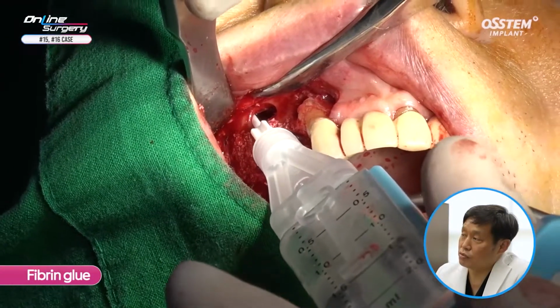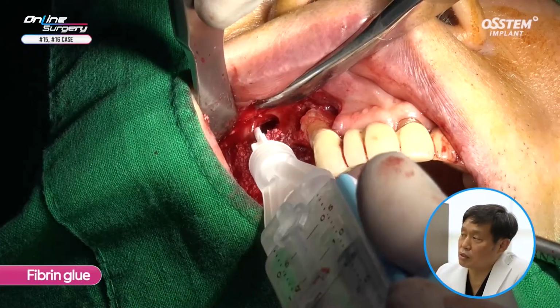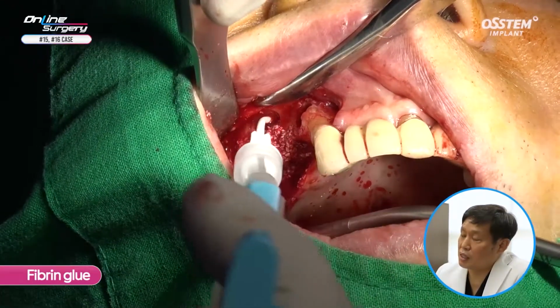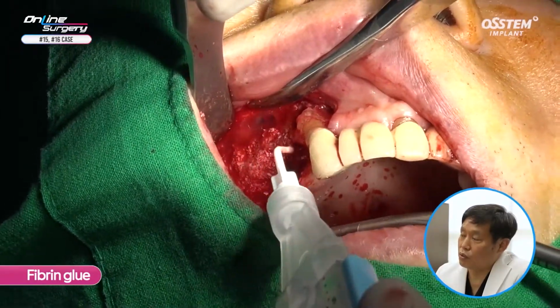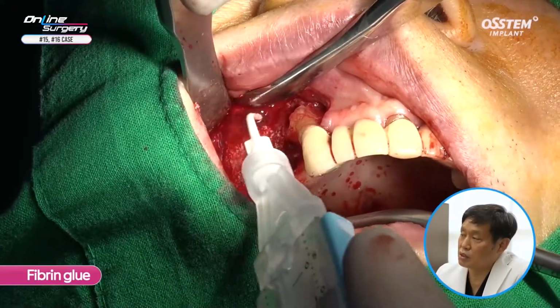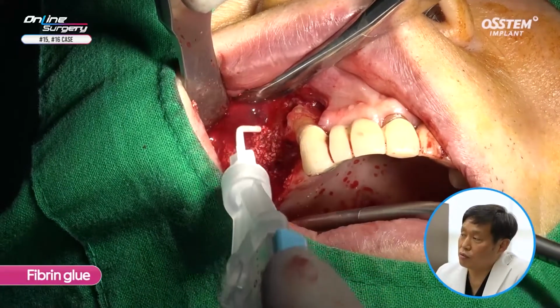Because the membrane was perforated slightly, I'm using fibrin glue to repair the sinus, and I'm also applying fibrin glue on top of the bone graft to fixate it.